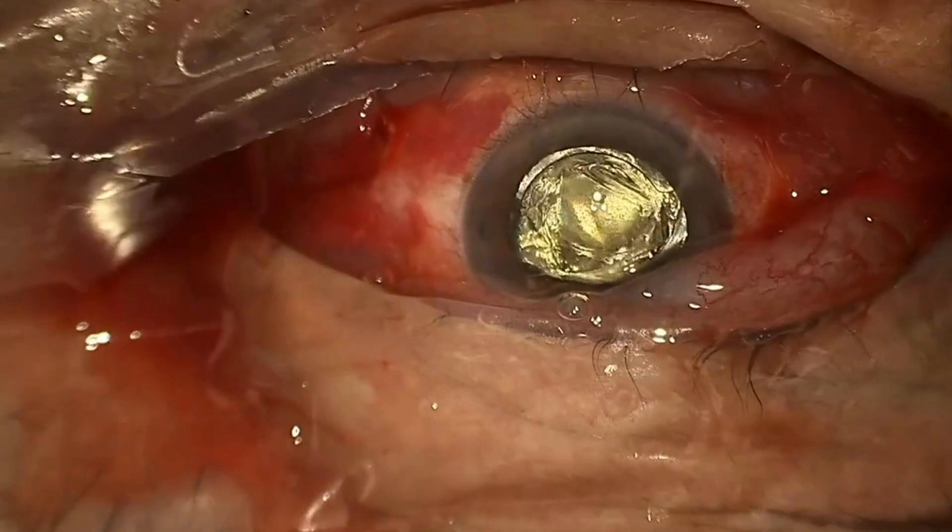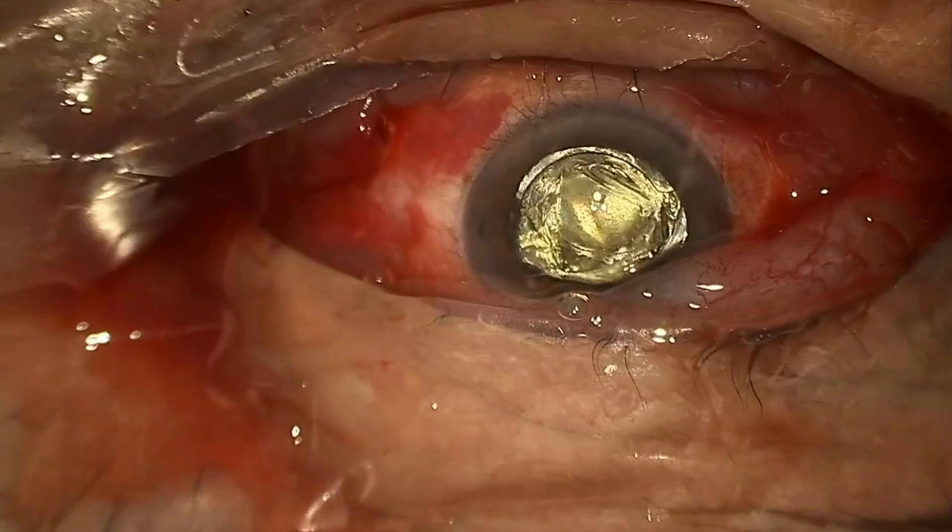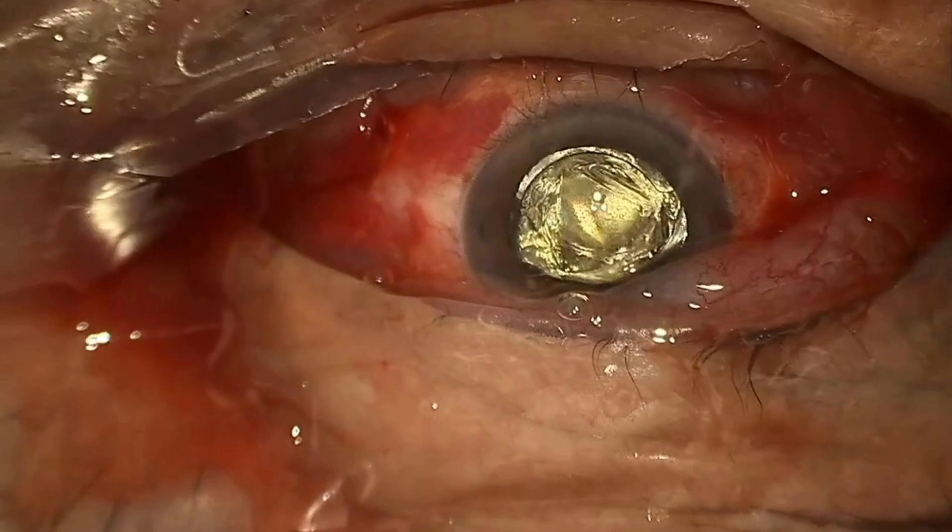Adding a little bit of extra laser has been shown to be helpful. So every once in a while I might supplement the existing retinopexy with some additional laser a couple of weeks before the oil comes out. I have a low threshold to add supplemental laser around these areas for the same reason — I tell patients there's about a one-in-five chance of redetachment when you look at all comers once the oil is removed. That rate is probably artificially influenced by some of these really disaster cases where unfortunately oil just needs to be left in long-term. You take the oil out, they look great intraoperatively, and then they're back with a total RD two weeks later from PVR or a new break.